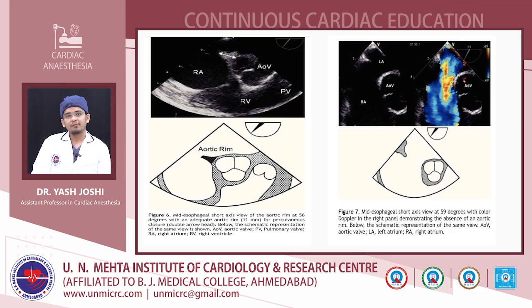In this image, the aortic valve short axis view, we can see the aortic rim. In the second figure, we can see the absence of the aortic rim. In such cases, these patients are not ideal for device closure, as the ASD device might impinge on the aortic valve.